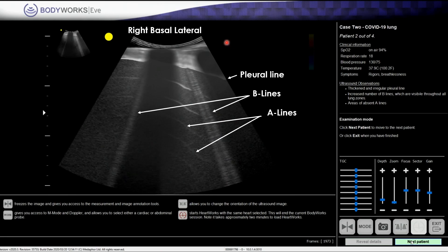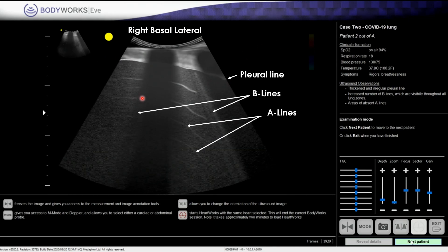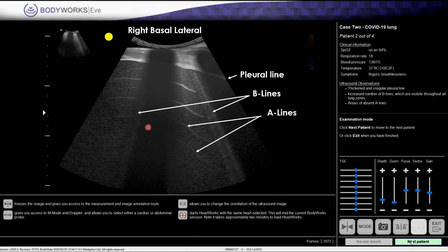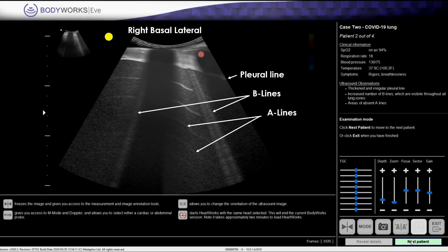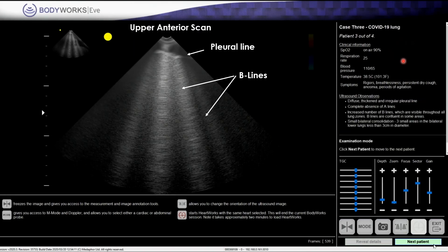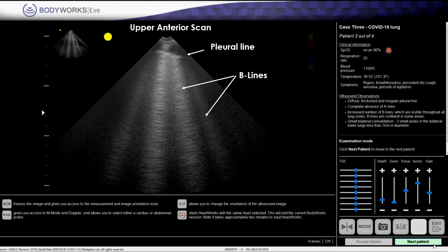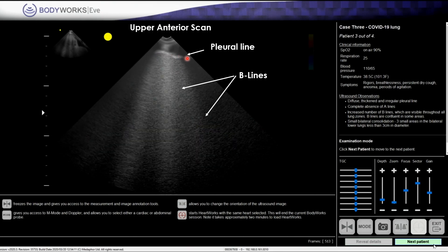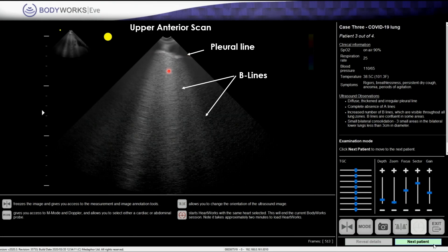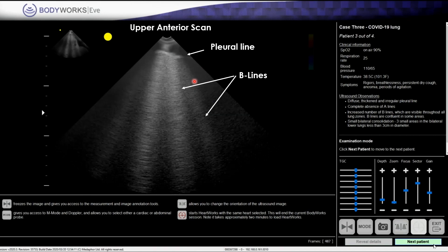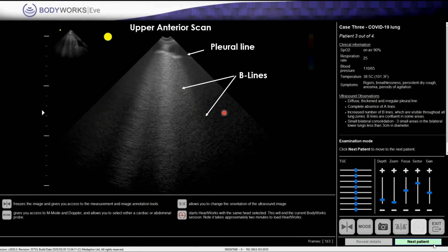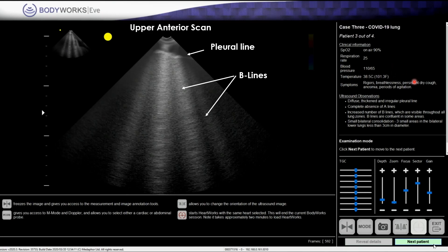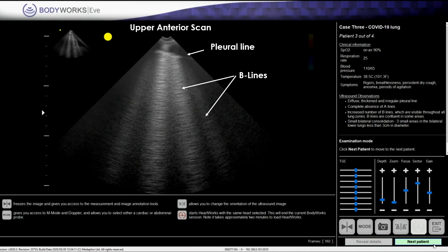In the same patient's right basal lateral scan, you see an irregular, thickened pleural line with more B-lines appearing, some A-lines dropping out, though not definitive given rib shadowing. As the patient progresses — temperature about 101.3°F, room air sats 90%, faster respiratory rate, periods of agitation, and persistent dry cough — the pleural lines become even more thickened and irregular, very diffuse and thick, with a complete absence of A-lines and a preponderance of B-lines visible throughout all lung zones, along with some consolidation in the bases.